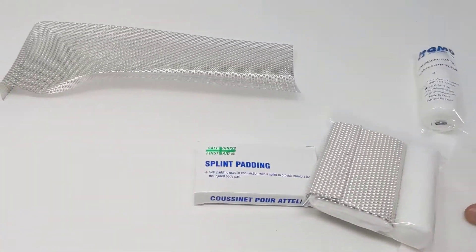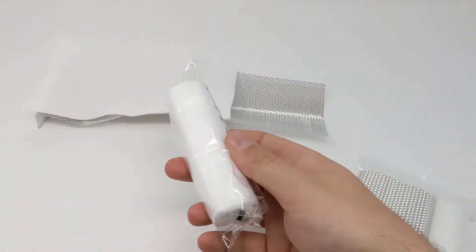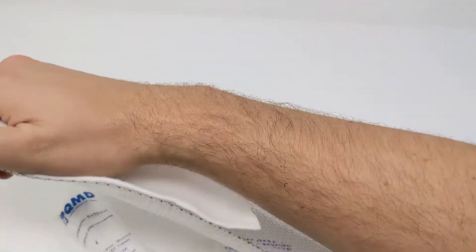And then you can add on padding to soften it up and, again, secure it with roller gauze or any sort of other wraps such as an elastic wrap or vet wrap.